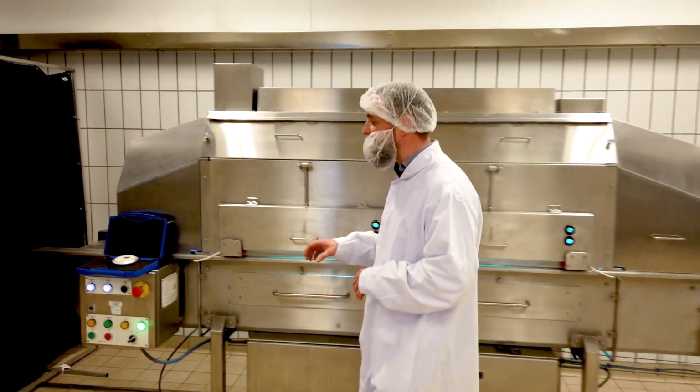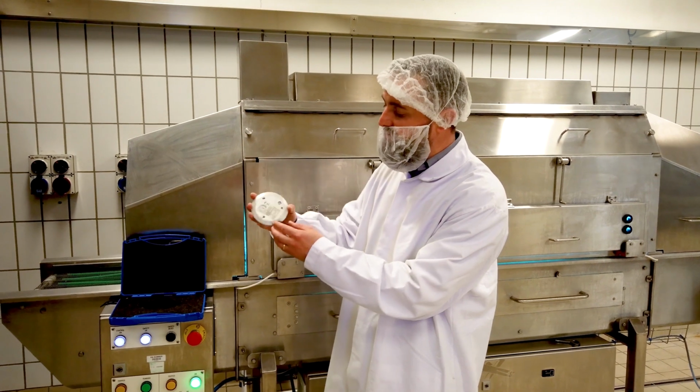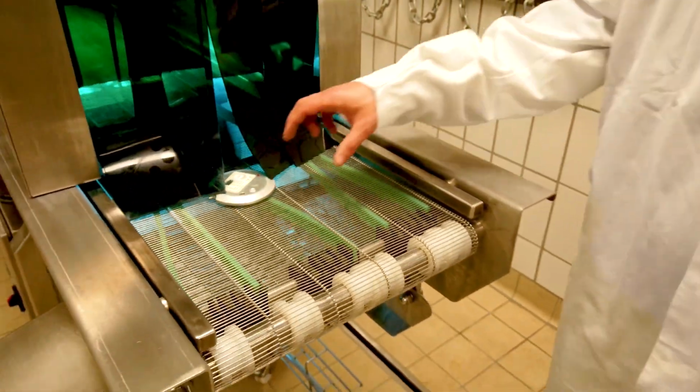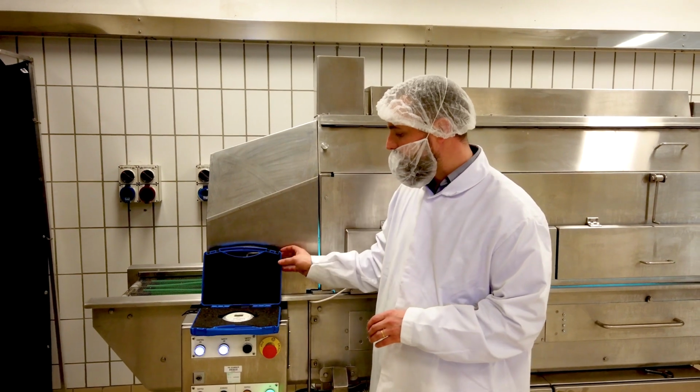Over here we have a sensor that we will use, and this sensor is used for monitoring the dose. So we will monitor the dose of a system where a manufacturer has validated that dose to deliver a certain level of inactivation, and then they use these dose sensors to verify that their system is always delivering over that threshold dose.